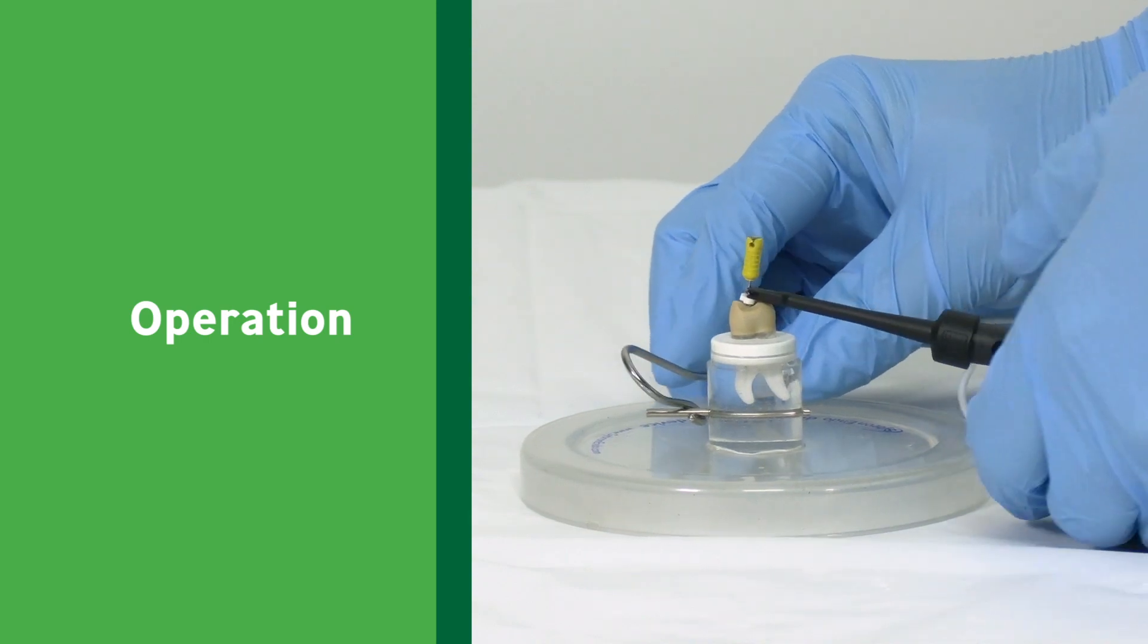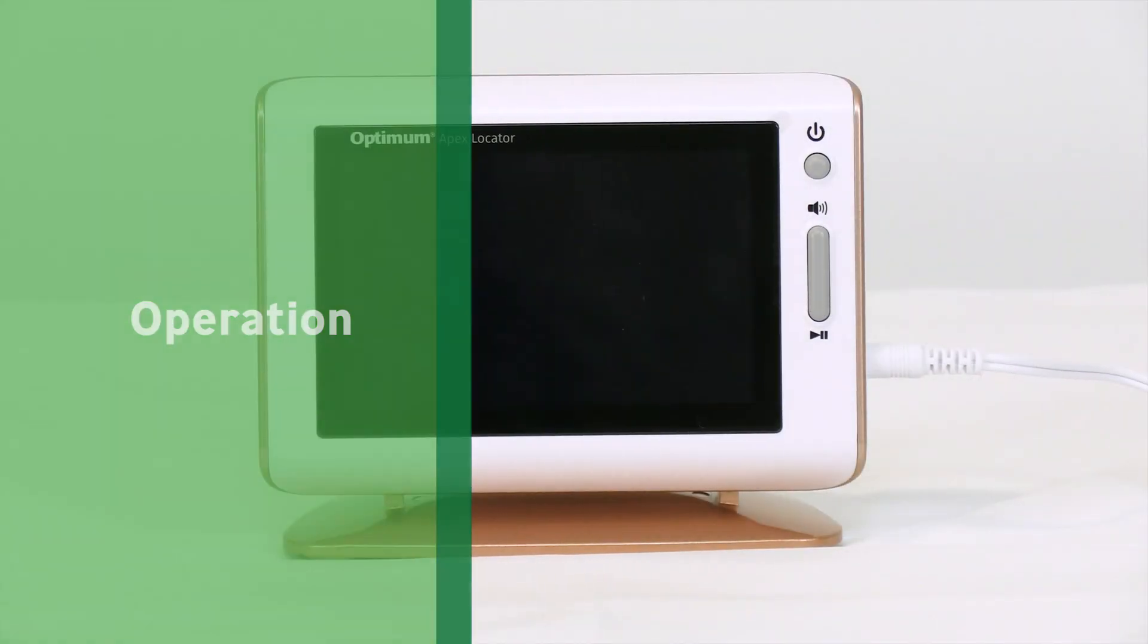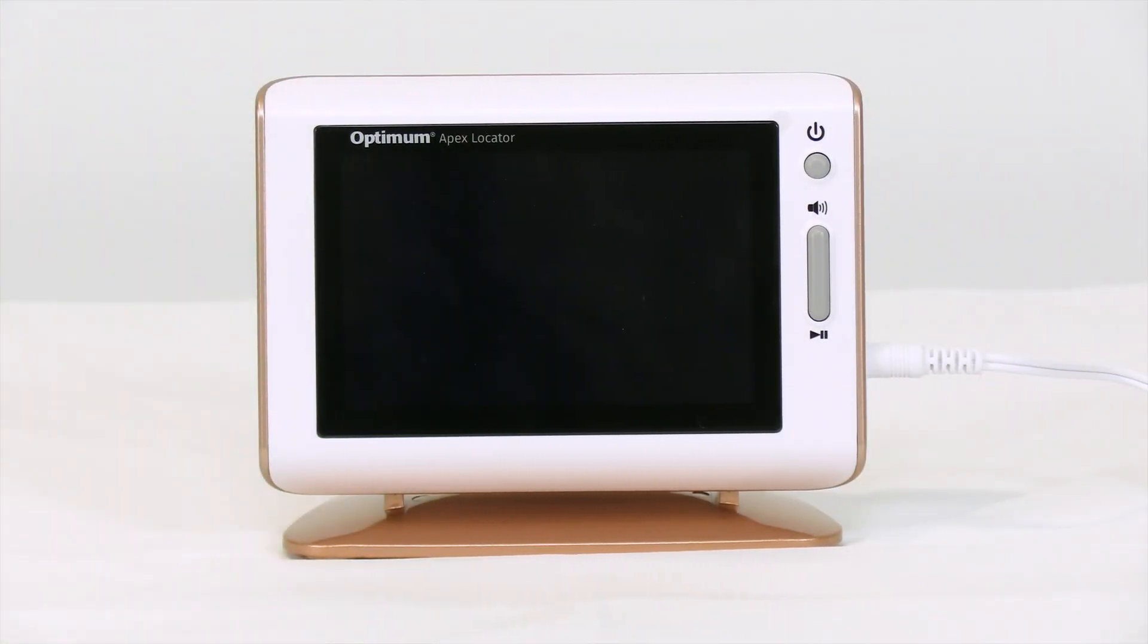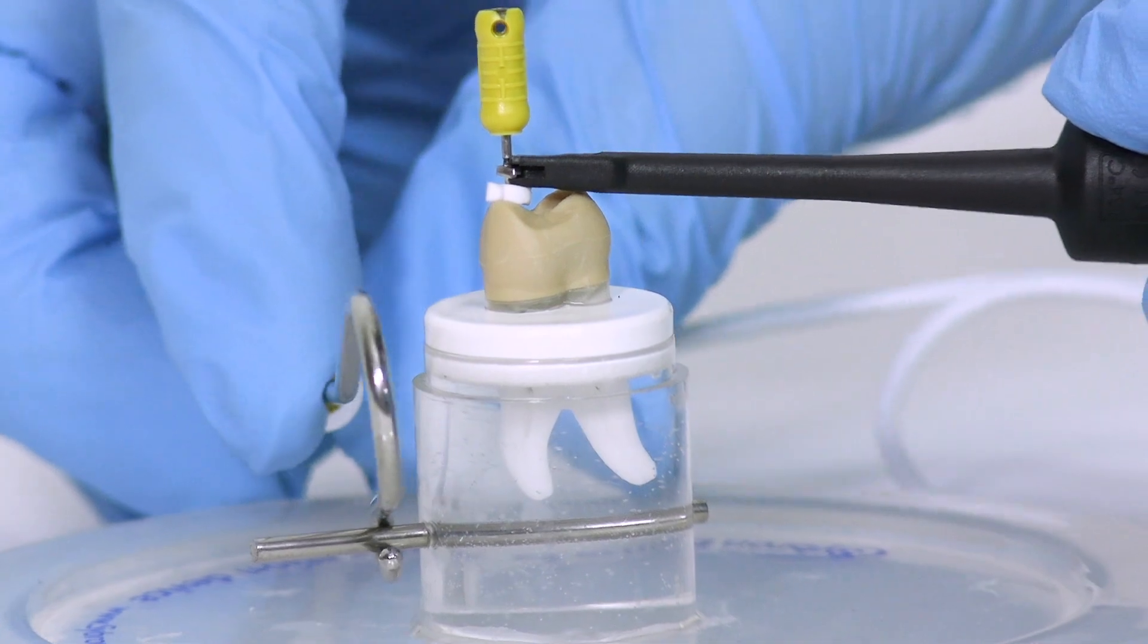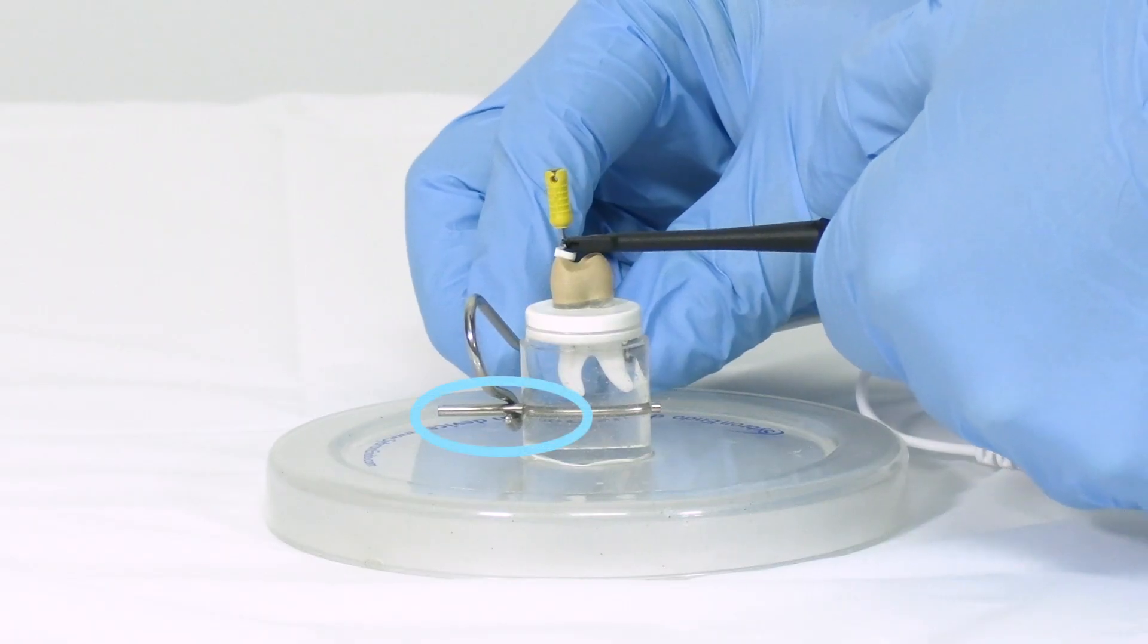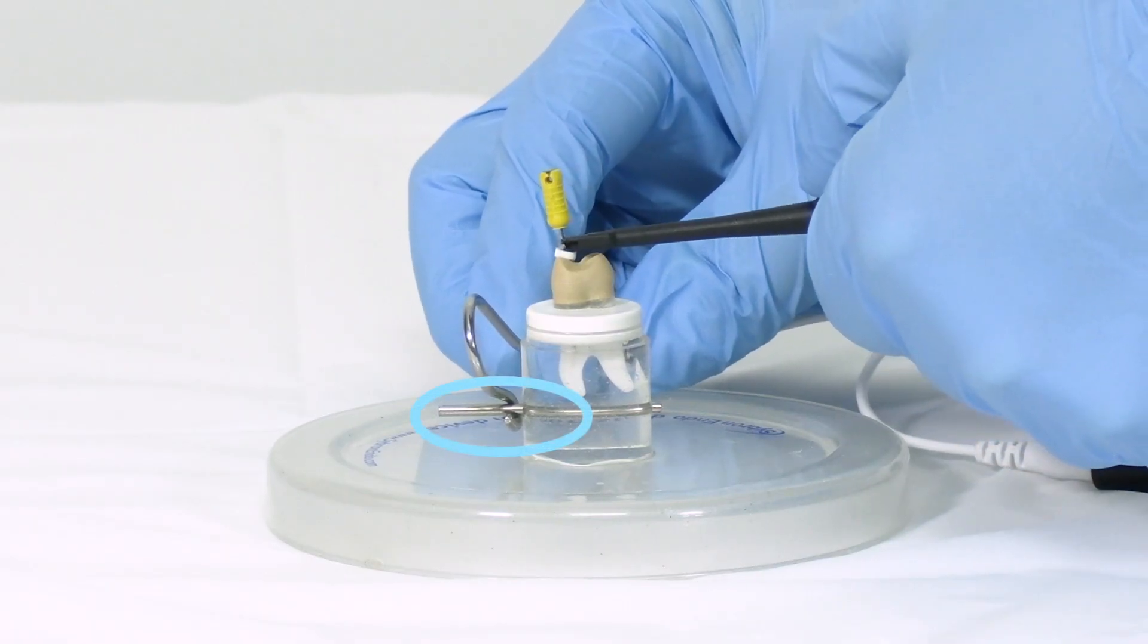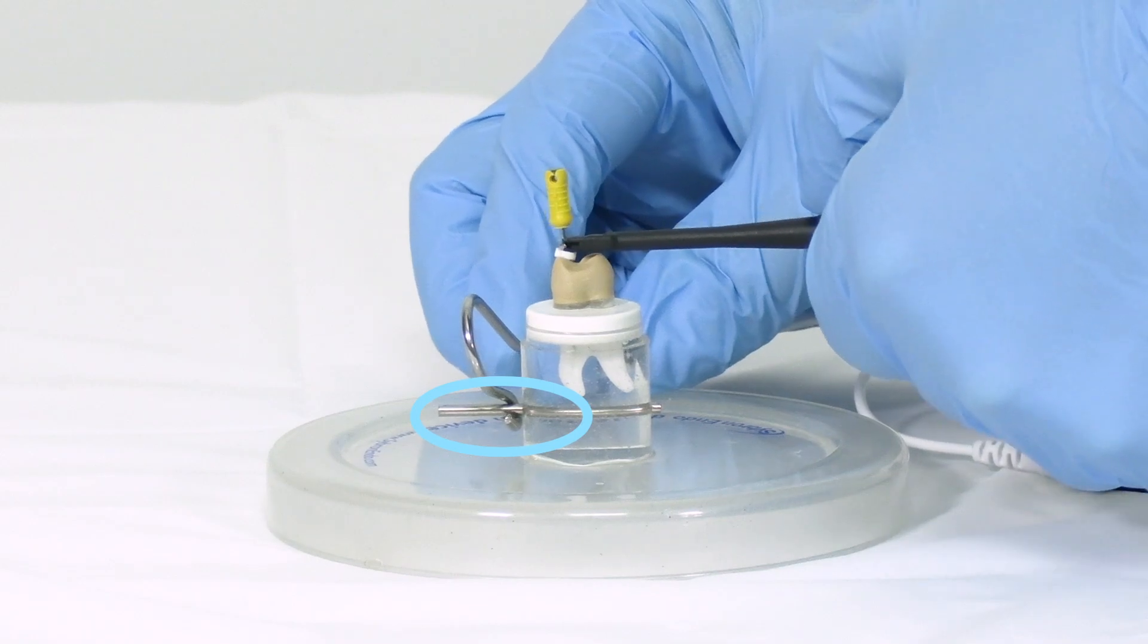Operation. Once the device is properly set up and ready for use, power the unit on. Hang the lip hook on the patient's lip. In this demonstration, the metal bar on the left side of the demonstration device will serve as the lip.